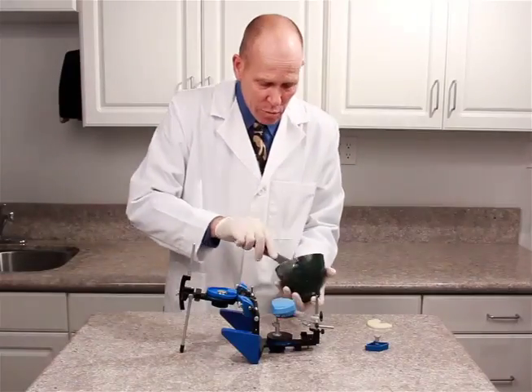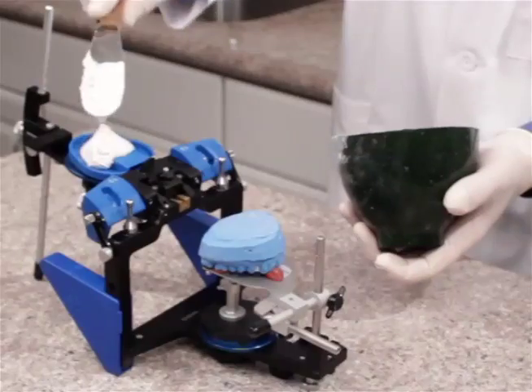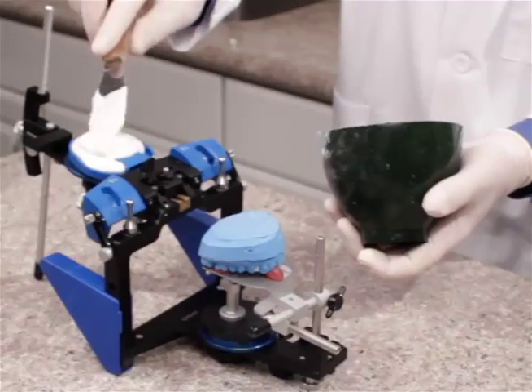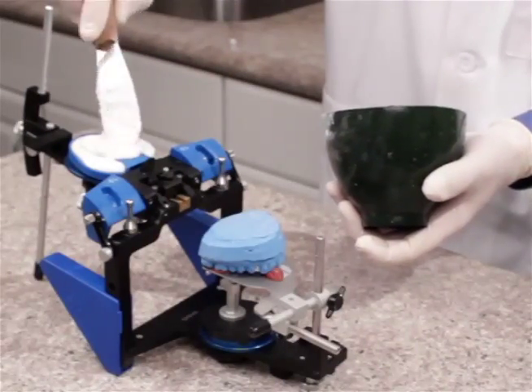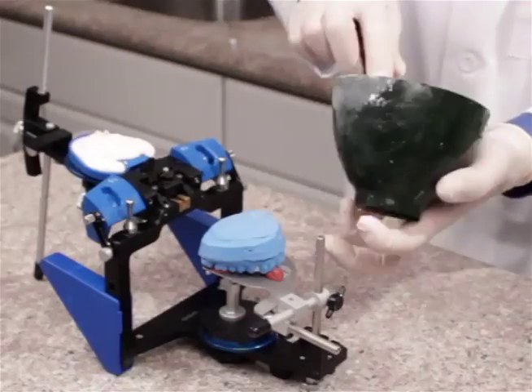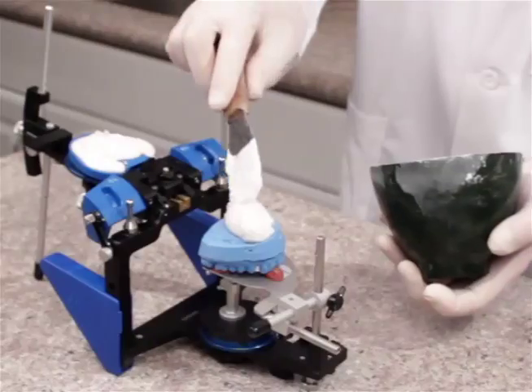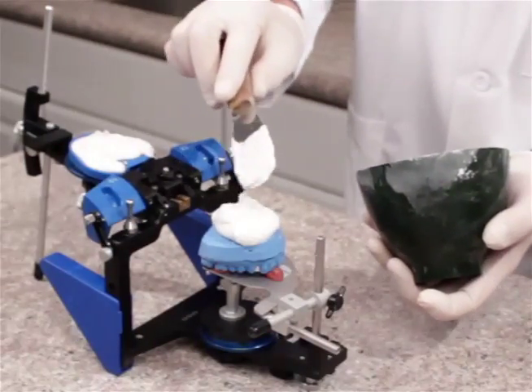We'll mix the plaster and add some first to the mounting plate, making sure we get it around the center retention lug really well. We also want to fill that mounting plate up because we have some retention tabs along the lateral edges of the plate. Then we'll add a little bit of plaster to the model so we can make a connection to the mounting plate — we don't need too much, so just a little dab.